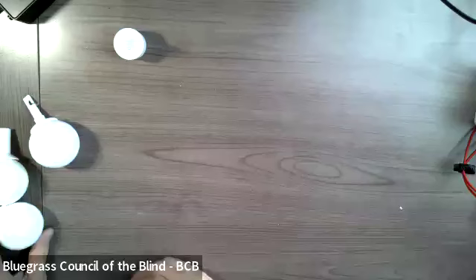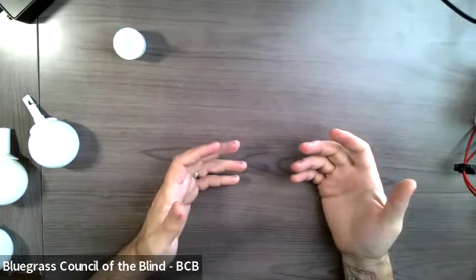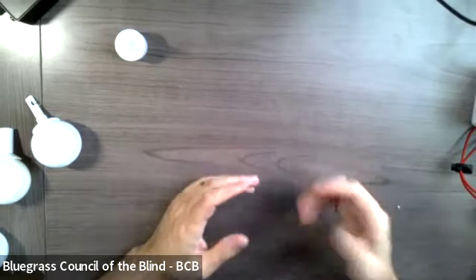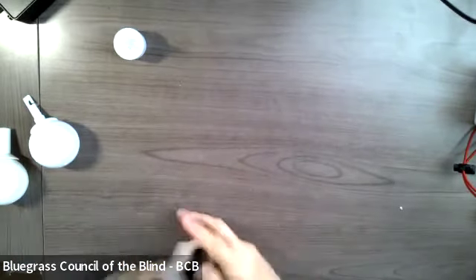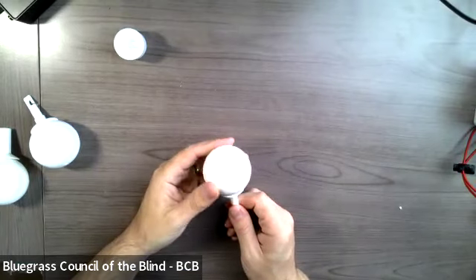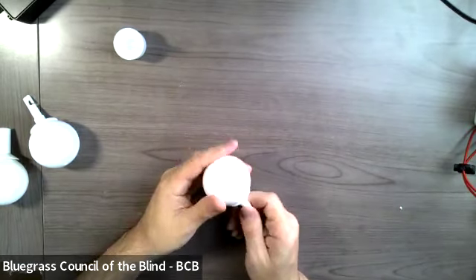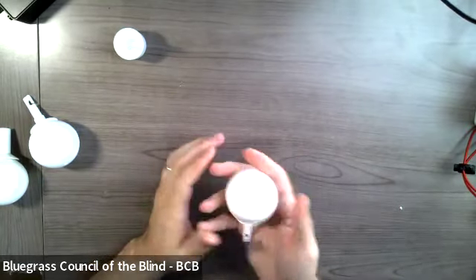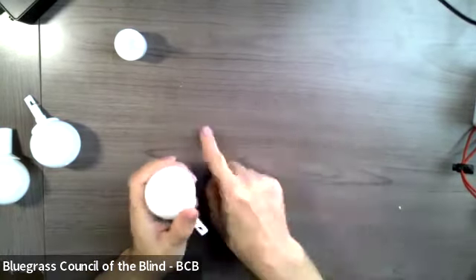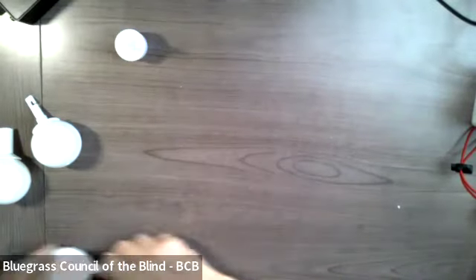Rolling ball tips are great. I refer to them as the Swiss Army knife or the all-terrain tip for a cane because they can go over just about anything. They are so big, they roll over most obstacles. You can even use these in certain terrain like grass and things. But it is large. It's heavy. So if you are a 2-point touch user, which means you tap your cane back and forth, side to side, this is going to be maybe a little heavy for you.